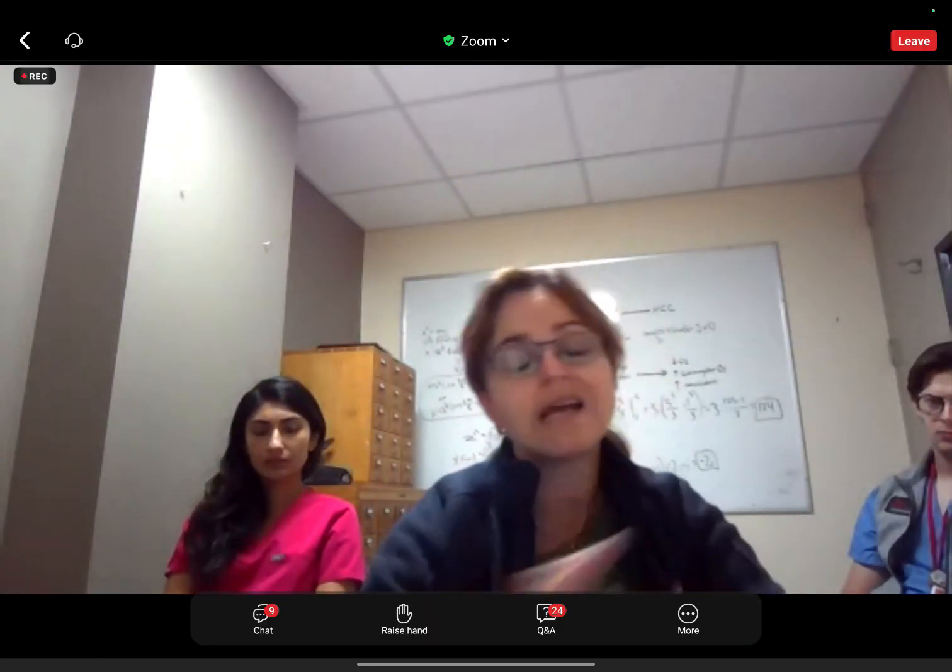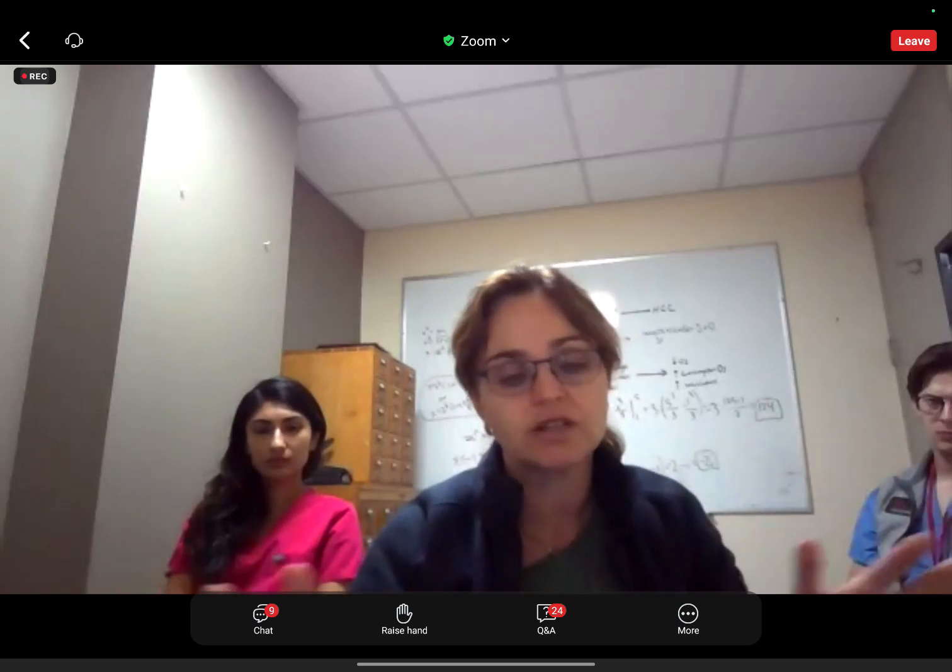In some cases, the patient bucks out and doesn't get hepatobiliary phase. Now you have at least the backup transitional phase. In some cases, the patient is dancing on the table and that one transitional phase is the only one that kind of looks okay. So under ideal conditions, when everything is perfect, you really don't need to have a transitional phase because it's not additive. But it's there because sometimes it's helpful if something goes wrong, and it's at no cost whatsoever in terms of time or effort.